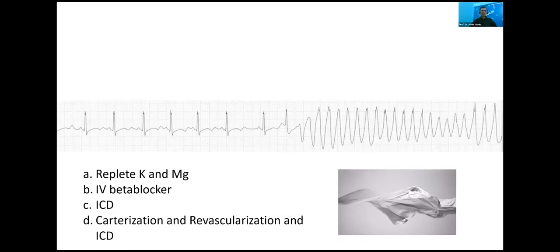A long QT. Do you have a longer strip? We want to see whether it's a torsade. You can see the twist, Wadud. Yeah, but it would have shown it beautifully.